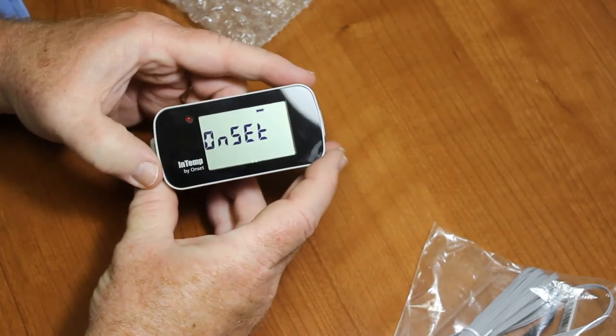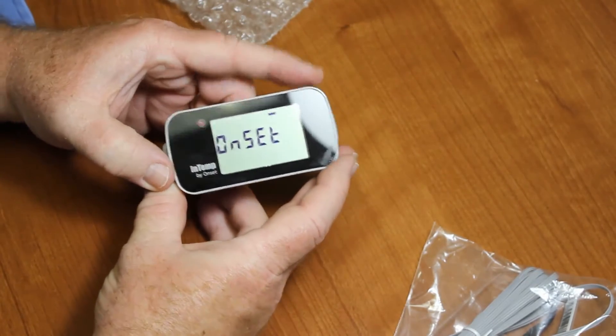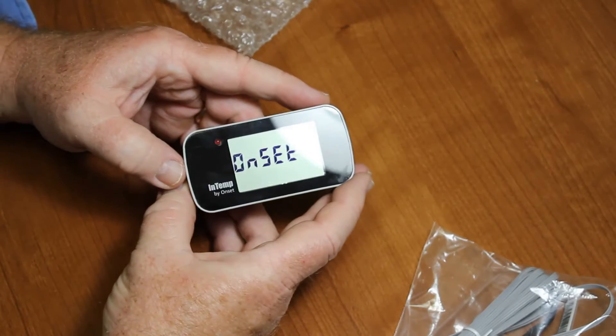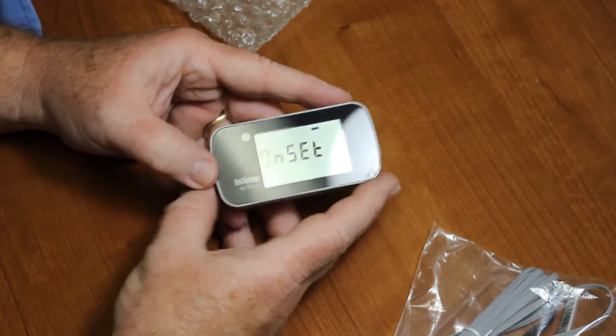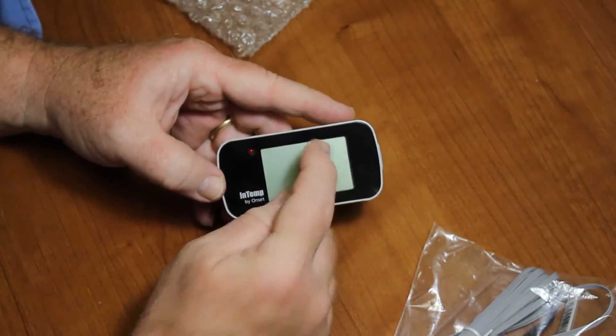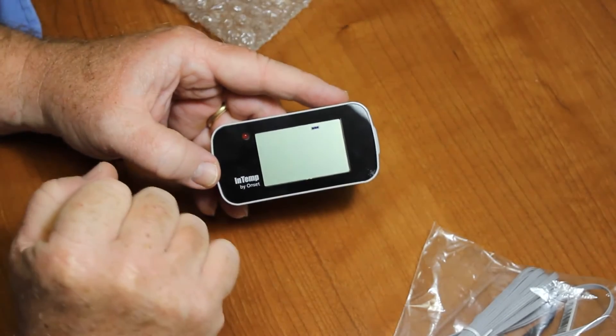There we go, and so it is booting up now. And we see the little battery indicator at the top of the screen.